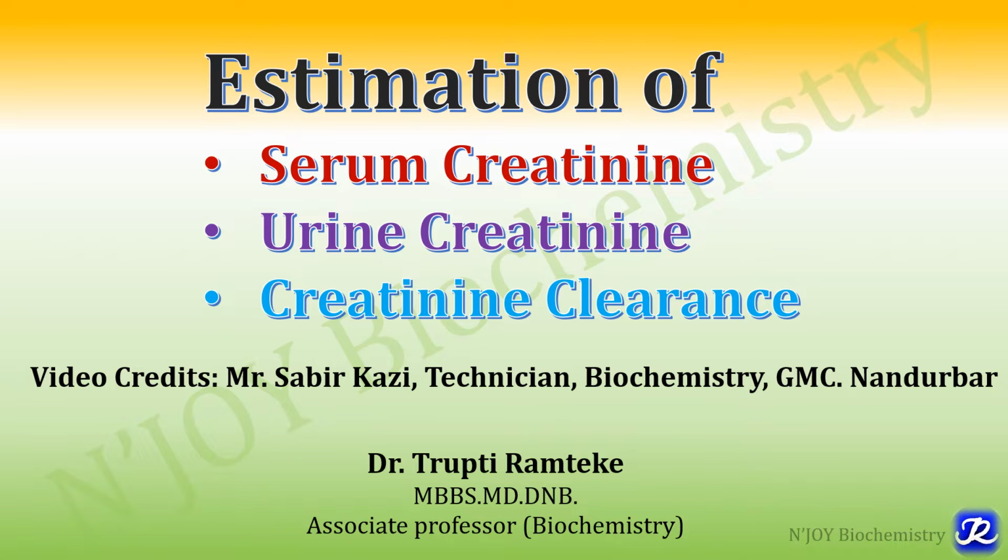In today's video, let's learn about estimation of serum creatinine, urine creatinine and creatinine clearance. At the outset, I am thankful to Mr. Sabir Kazi, technician at Department of Biochemistry, GMC Nandurbar for performing this experiment.